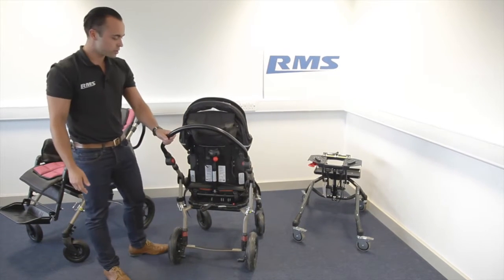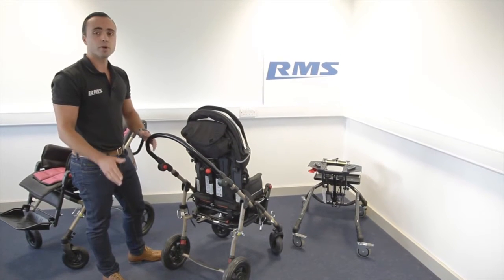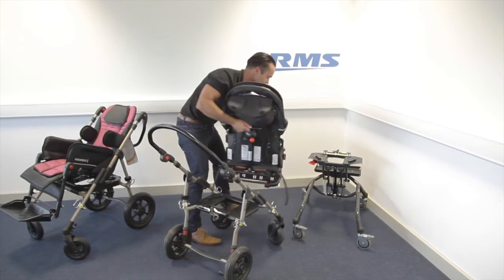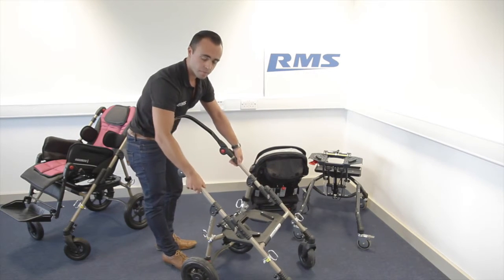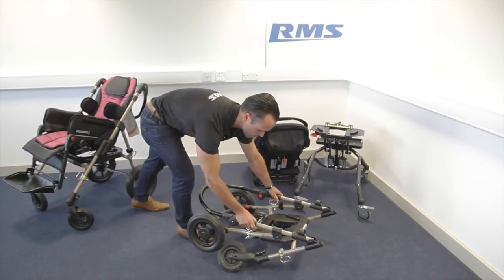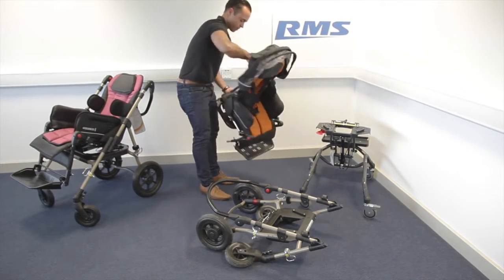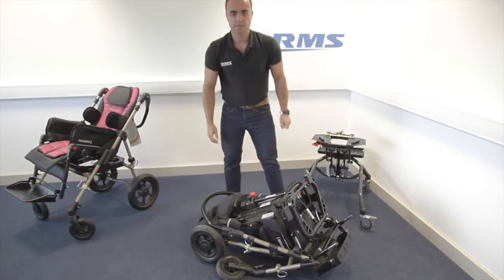To fold the buggy in a compact way so it can go in the boot of the car, the best way is like this. Remove the seat, push these two buttons, and then the most compact way is like this.